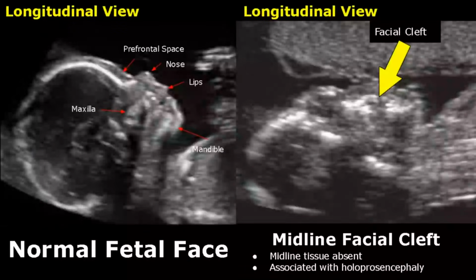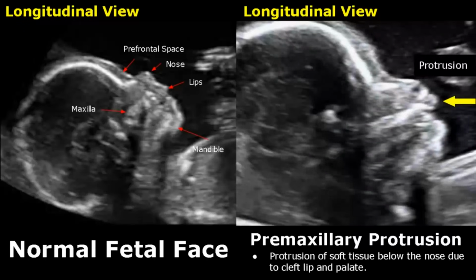Midline facial cleft is associated with Holoprosencephaly. The face is deformed and there is absence of normal midline tissue. 3D ultrasound and MRI are much better modalities for such abnormalities.